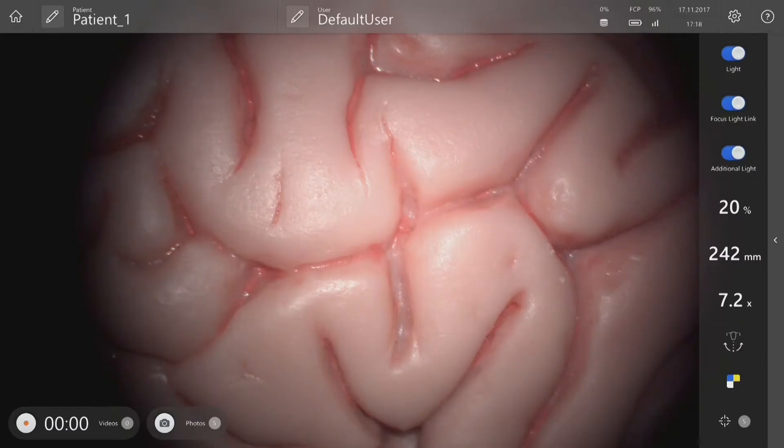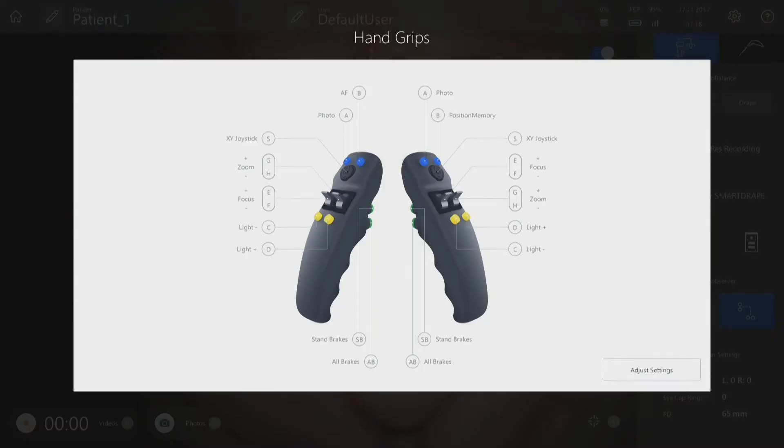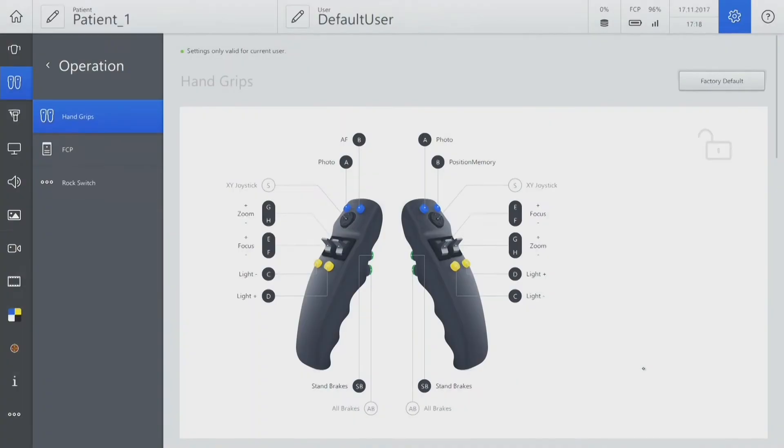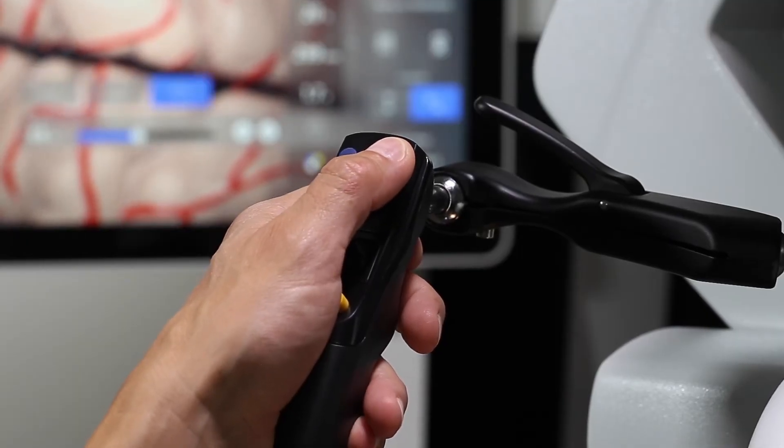To configure handgrips for activating different modes, open the handgrip icon from the main screen. Go to Adjust Settings. Configure XY mode to one of the buttons. Pressing this button enables toggling between different modes.